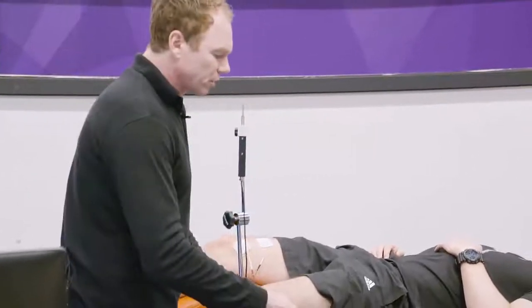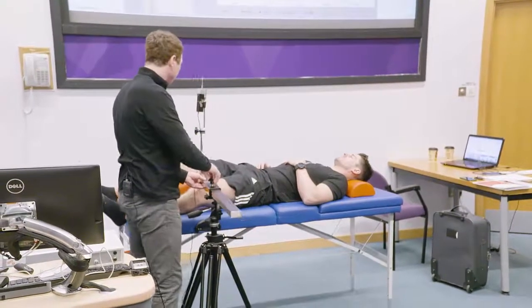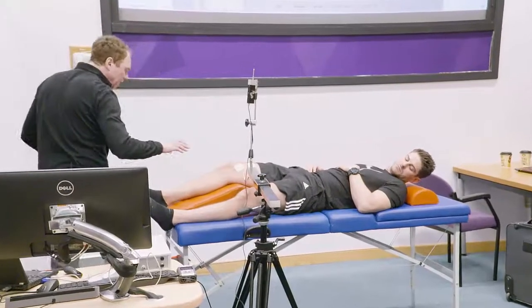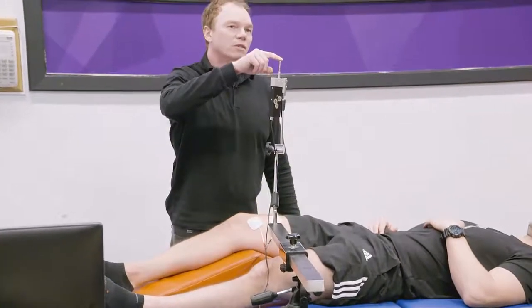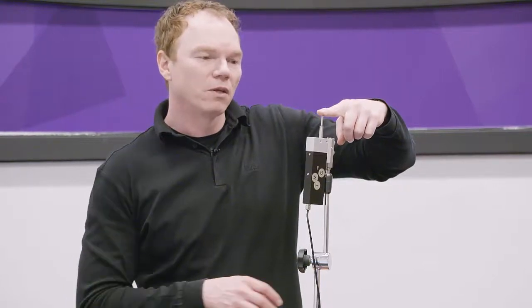The next step is positioning of the sensor. Before I position the sensor, I will make some comments about how the sensor should be positioned. The amplitude of the sensor tip is 32 millimeters. The displacement — DM — was somewhere between 2 and 15 millimeters. That means you shouldn't press more than half the sensor tip in when positioning on the muscle.